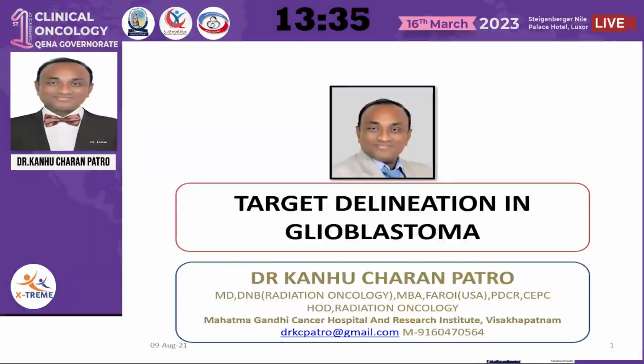Good evening, everybody. Today, I am going to talk about target delineation of glioblastoma in radiotherapy aspects. I am Dr. Kanhu Charan Patro, neuroradiation oncologist.